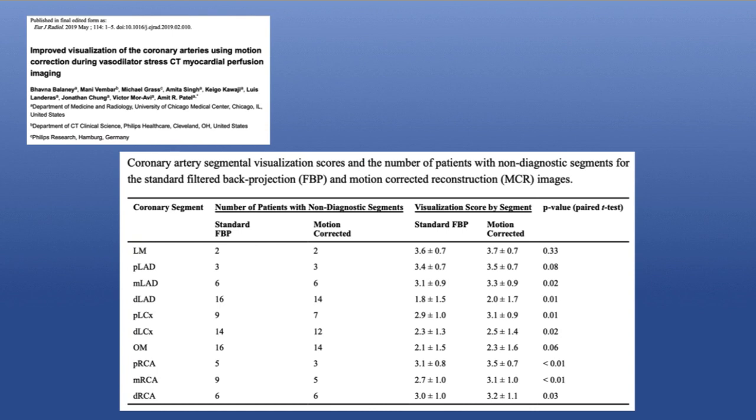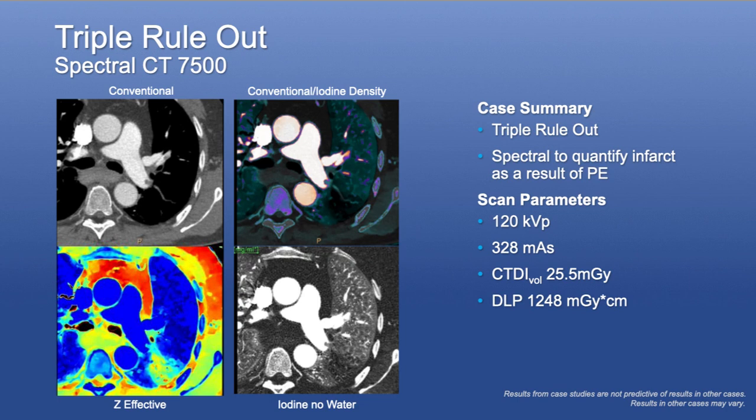Usually what we do here is we give patients, the outpatients, metoprolol the night before the CT and the morning of the scan. But sometimes you cannot do this. Maybe if the blood pressure is borderline, or if it's particularly a small patient, frail patient, you may not want to give them metoprolol, or if the baseline heart rates are very, very fast from the beginning. So in this way, this can help you still image these patients.